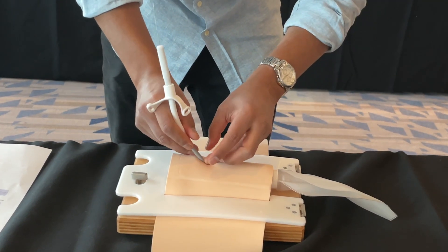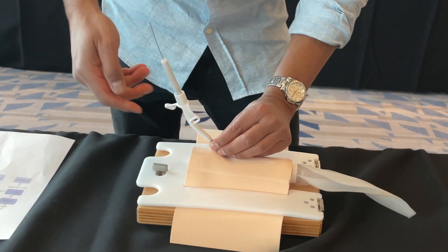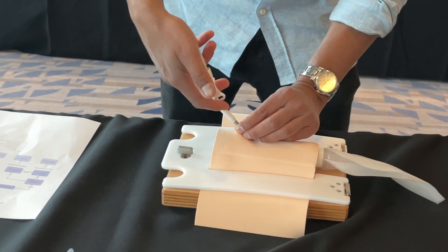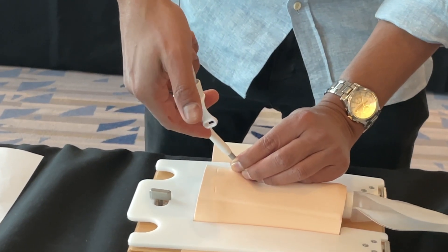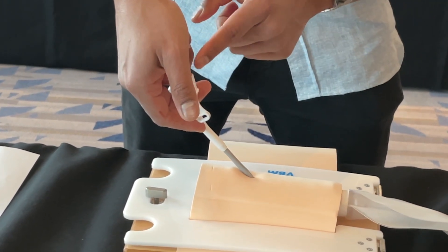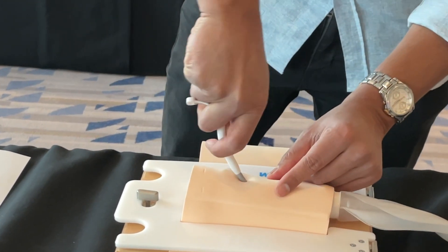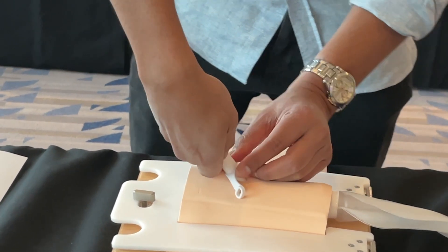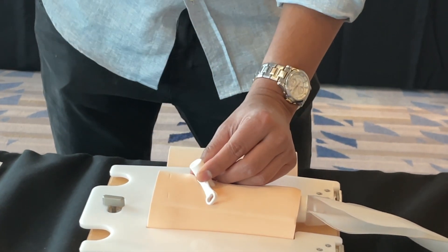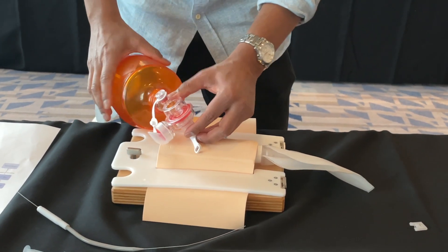Pass the wire — you always want to see the wire before you start your motion. The most important thing is all three devices — wire, dilator, and Melka kit — are held together. The grip I use holds the wire without bending it too much, and I hold the dilator flush to the Melka kit. Then using a rotating motion, I pass it through and make sure it's inserted into the trachea. I take the wire and dilator out together, and once the Melka is in, I take my Laerdal bag and start test ventilating.